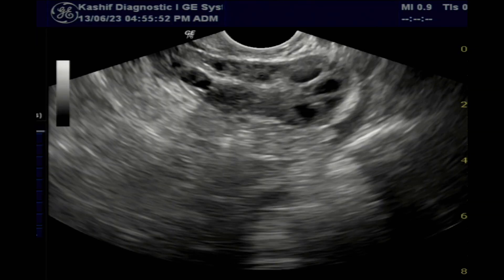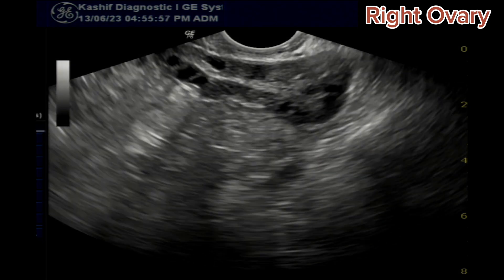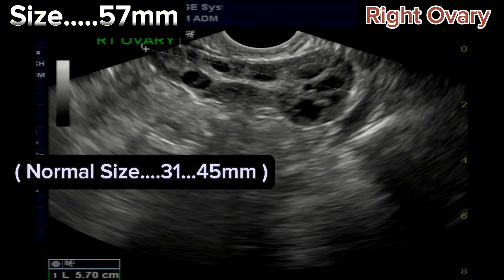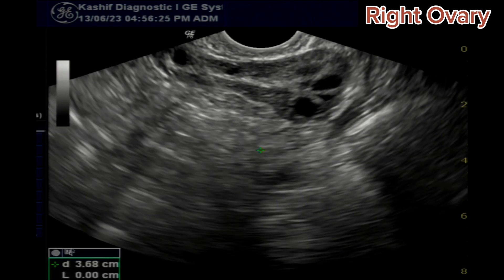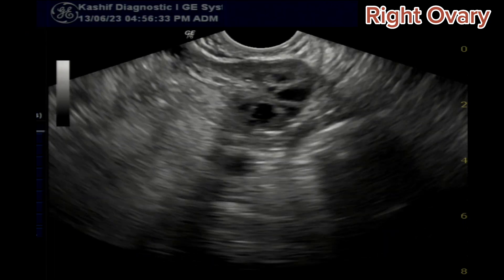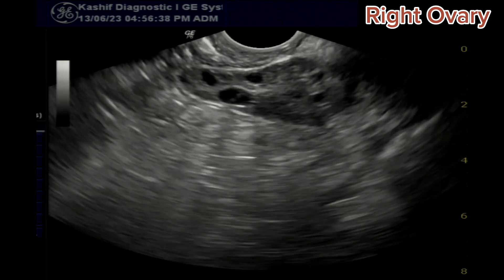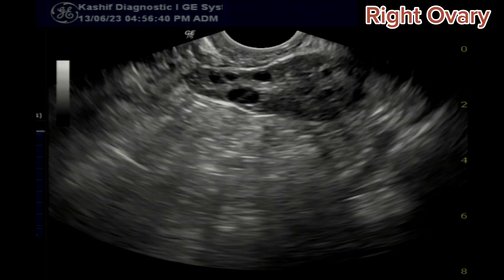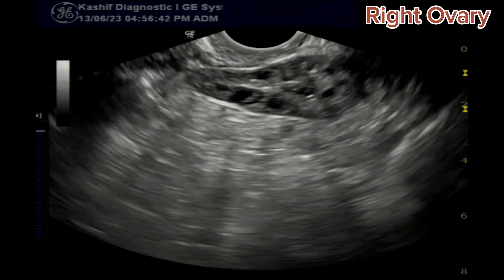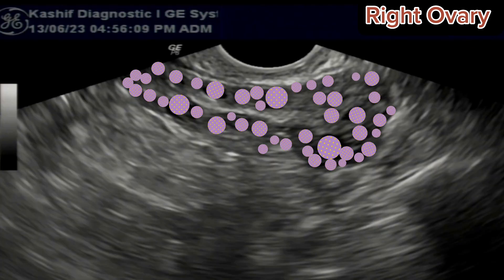Now the right ovary is visualized. We can see that the ovary is large and elongated. Its size is 57 mm — normal is less than 45 mm. The largest follicle is 7 mm. This is a 12th day scan, but we don't see any growing or dominant follicle. There are multiple small follicles, mostly peripherally placed, more than 25 in number, sized approximately 2 to 5 mm.